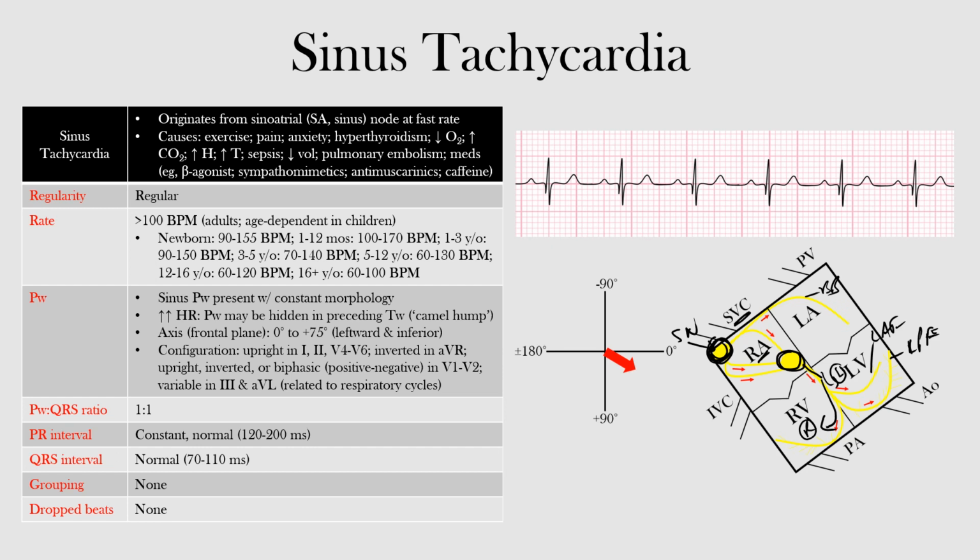So as long as you can recall this conduction system in your mind, as well as where the leads are placed, okay, identifying the sinus rhythm on the EKG is really not that difficult. In general, sinus tachycardia is often the result of a medication or a compensatory response of the body to certain conditions that require an increase in cardiac output, such as exercise, hypovolemia, hypoxemia, hemorrhage, or acidosis.